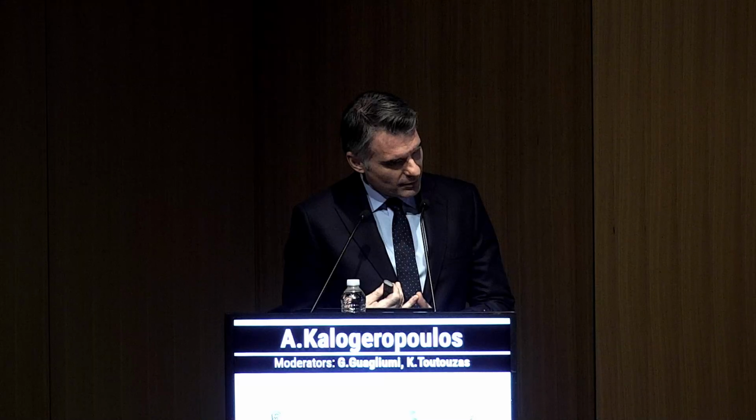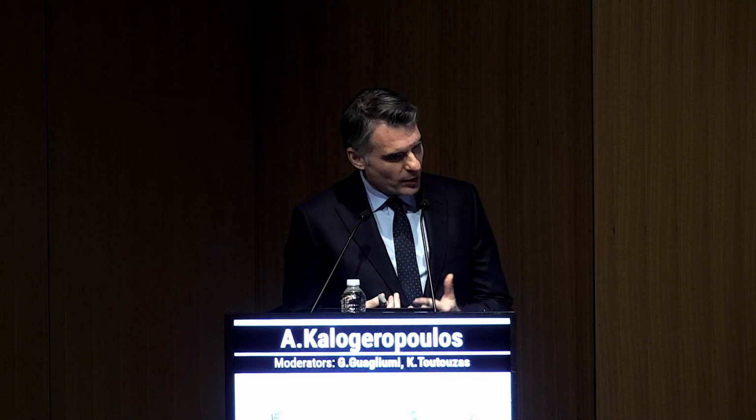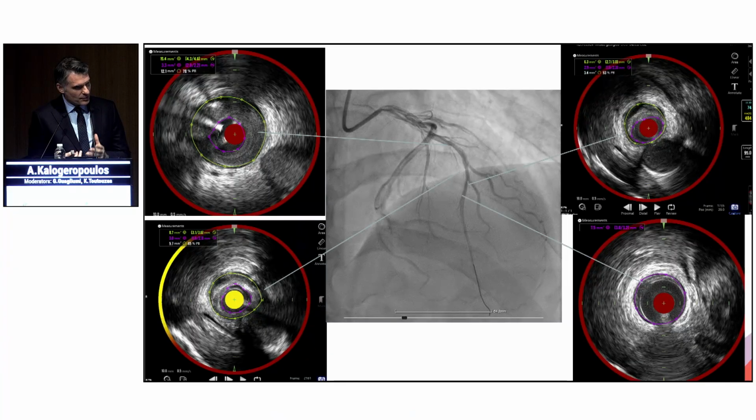Which is very interesting for a young patient of 42 to have these regional differences in the remodeling. So, essentially, we have the challenges of a long lesion, we have a young patient, and we have some vessel size discrepancies. So we need to choose now which is the most appropriate strategy to treat this case. Are we going to put metal stents, use drug-eluting balloons, or use bioabsorbable scaffolds?